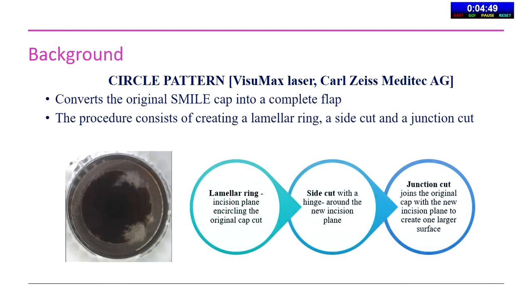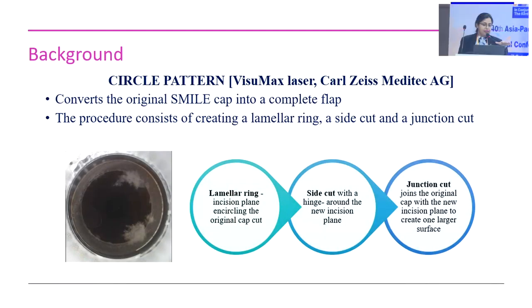A very good afternoon to all of you. I would be presenting our study on indication, safety and outcomes of circle pattern after small incision lenticule extraction. There are no financial disclosures. Circle pattern, as we all know, converts the original smile cap into a complete flap.